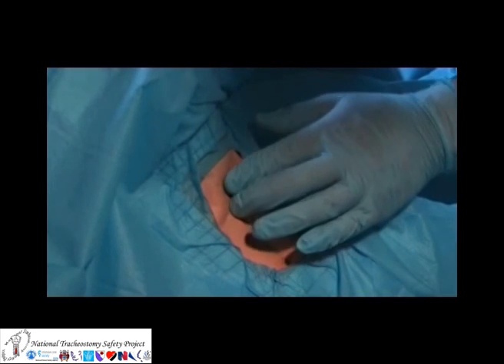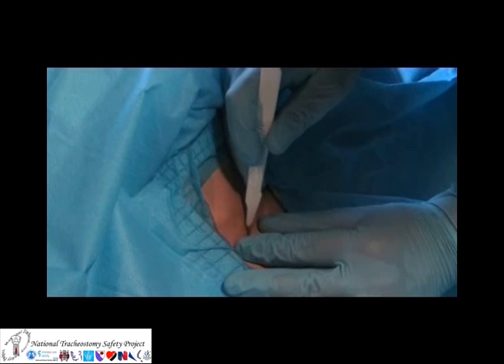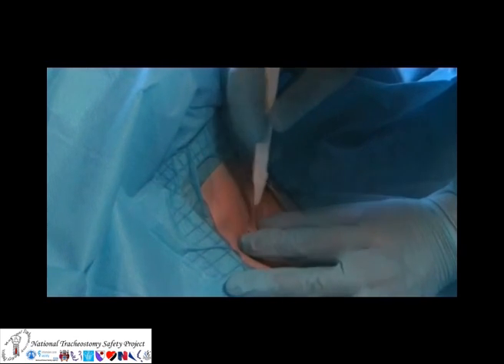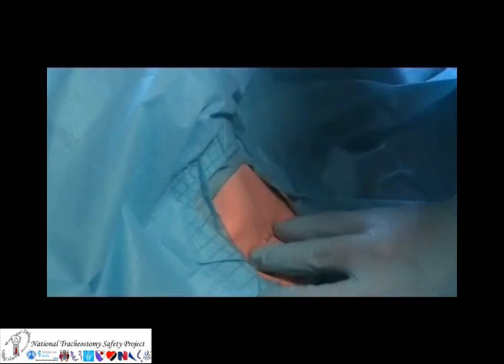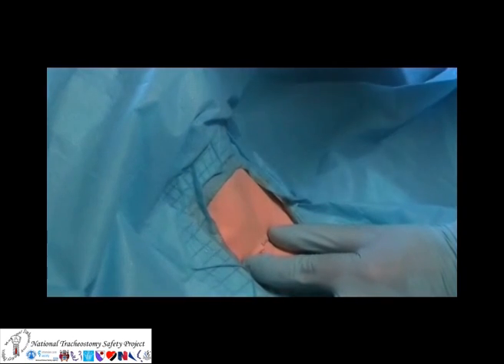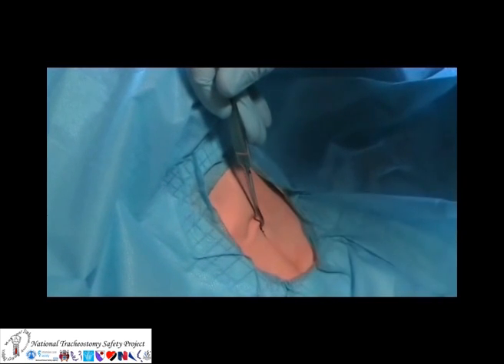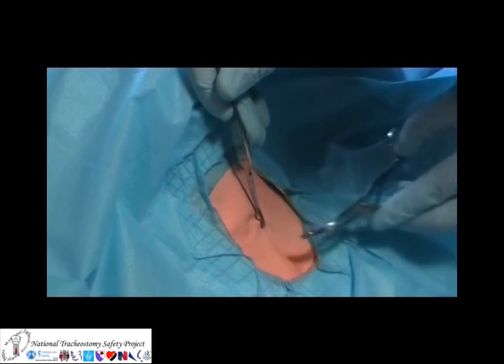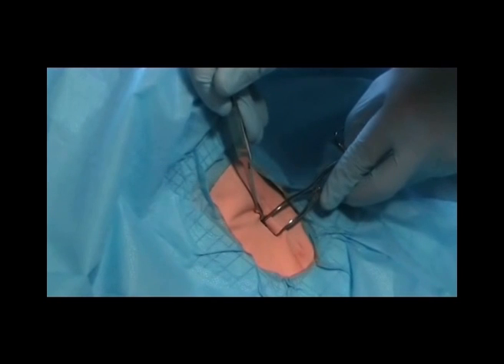A slightly more advanced surgical technique involves the use of a tracheal hook and tracheal dilators. The incisions are made as previously, but this time we will use a tracheal hook, which is inserted and then twisted cephalad in order to open up the cricothyroid membrane. Tracheal dilators can also be used, again to open up the hole and make insertion of the cricothyroidotomy tube a little easier.